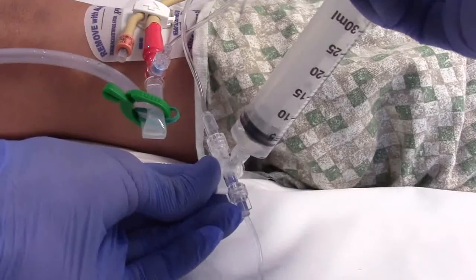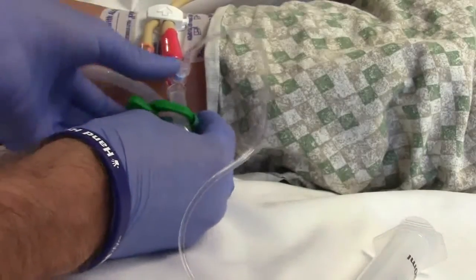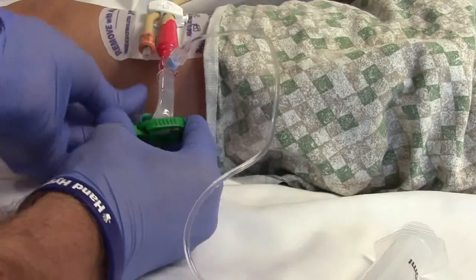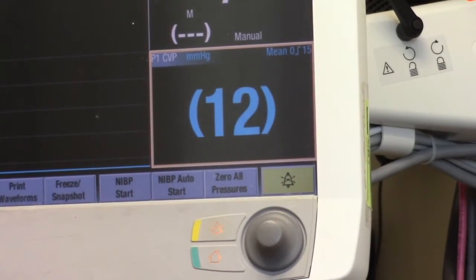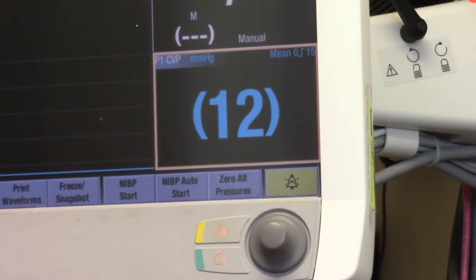Do not inject more than 25 milliliters into the bladder. Expel any air between the clamp and the urinary catheter by opening the clamp briefly and allowing the normal saline to flow back past the clamp, then reclamp. Allow 30 to 60 seconds after instillation to allow for detrusor muscle relaxation.